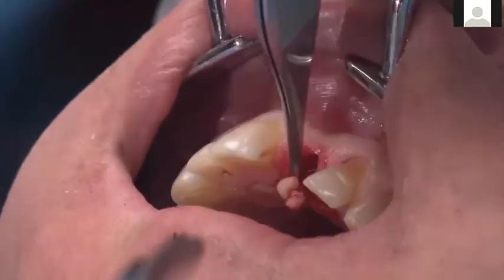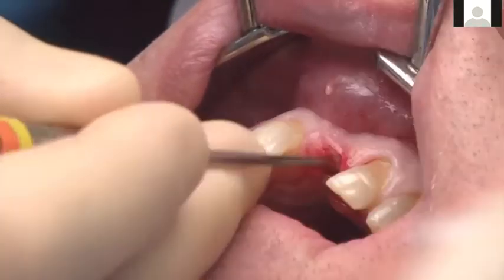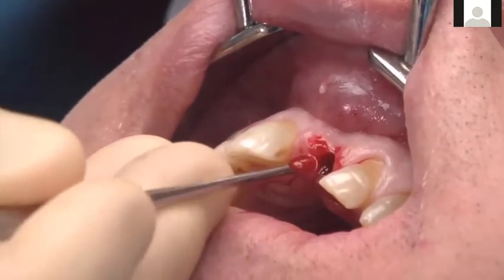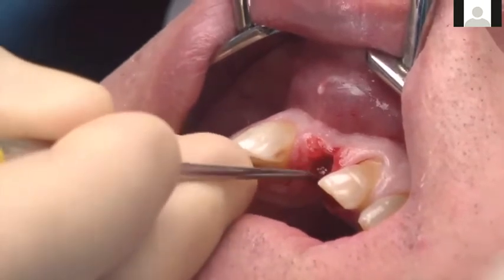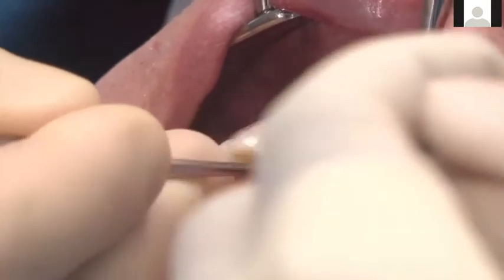So here's the punch tag that's been taken out. Then you can go around with your curette and curette a little bit more any residual tissue tag, so you have a very clean bone surface.